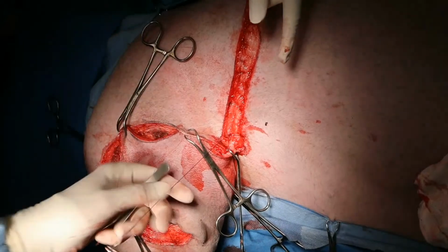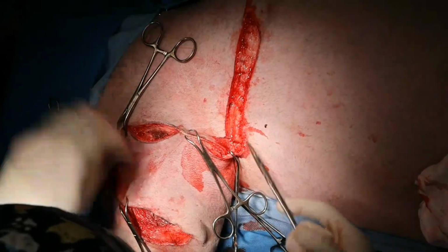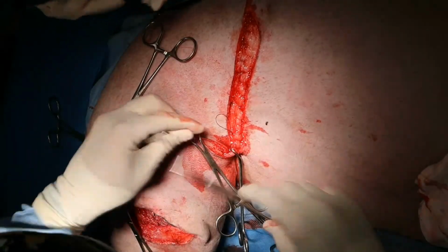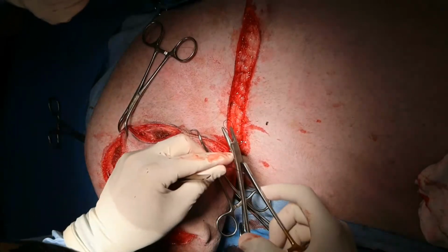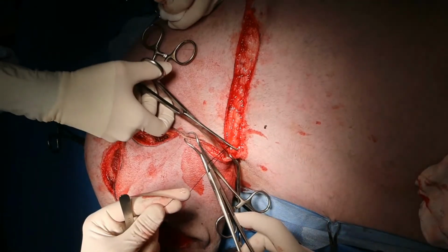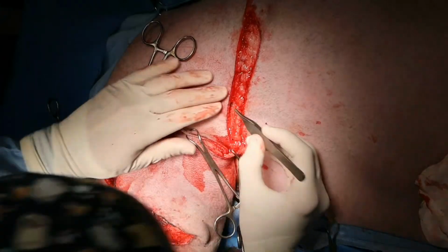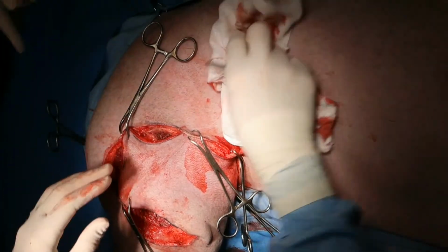All right, so that looks great there. So I might have you, Sonia, do an intradermal. Actually, do a kind of a superficial sub-Q. And we'll do skin on top. So the layer that I want you to get is this stuff here. Okay. You tell me, do you want to move where I am?